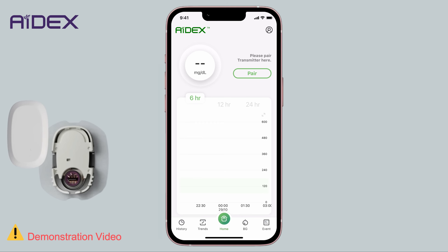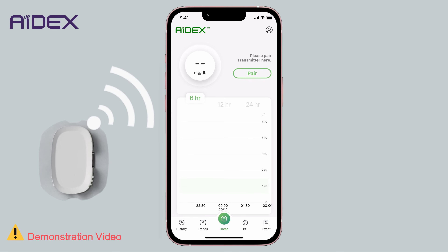The sensor contains a battery that provides power to the transmitter, allowing it to function. Because of this, the 8X transmitter can be used for up to four years without needing to be charged or replaced. This is why the pairing step with the application cannot commence unless the transmitter is attached to the sensor.